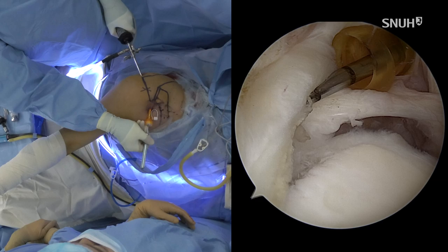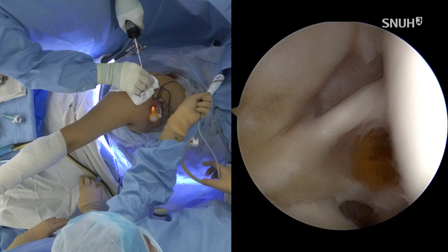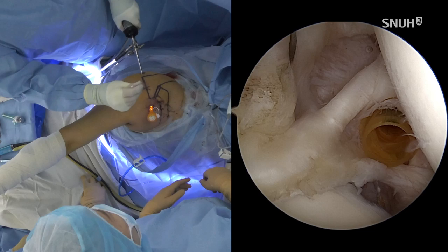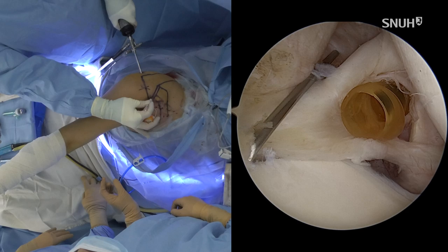I will further the decortication through the transrotator cuff portal. According to my paper in 2009, AJSM, the transrotator cuff portal is really useful because it is really easy to access the superior labrum. If we make an anterior superior portal this way, it's a little bit curved. It's not that direct. Sometimes this posterior fixation is not easy.